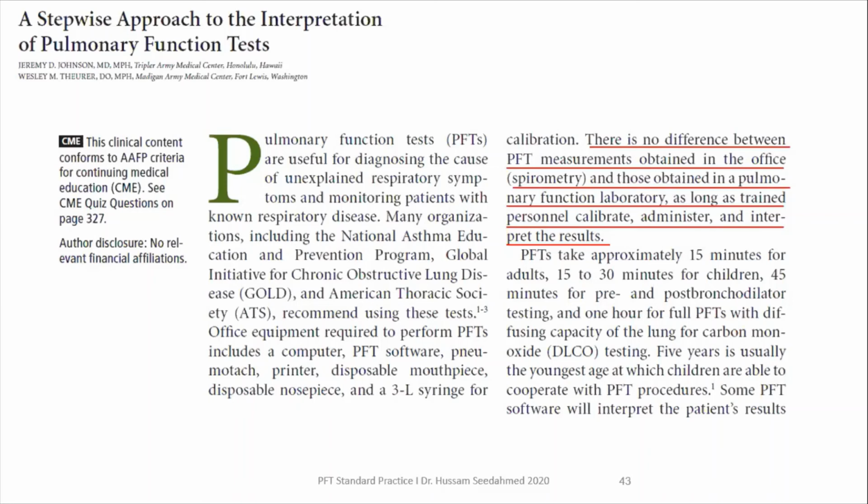Like echo, it is indispensable for the cardiologist. So we should attempt to have this idea that each one of us has his own spirometry in his clinic. Why not? Even in the referred clinic, especially with those patients with asthma. And especially now, after I hope I delivered the basic or simple information on how to perform a correct technique and how to interpret them correctly.